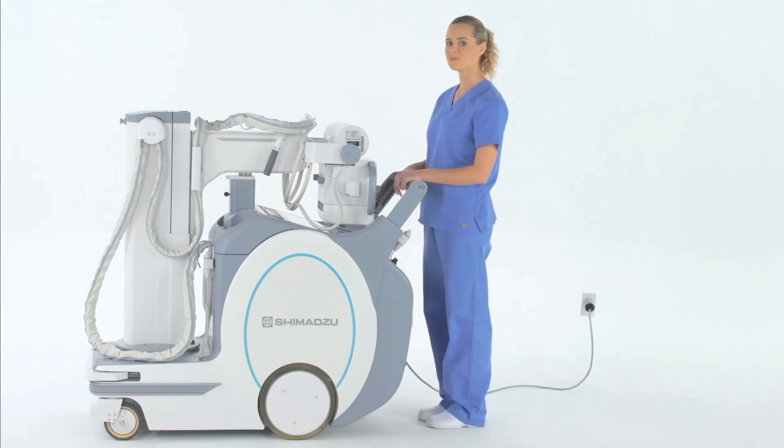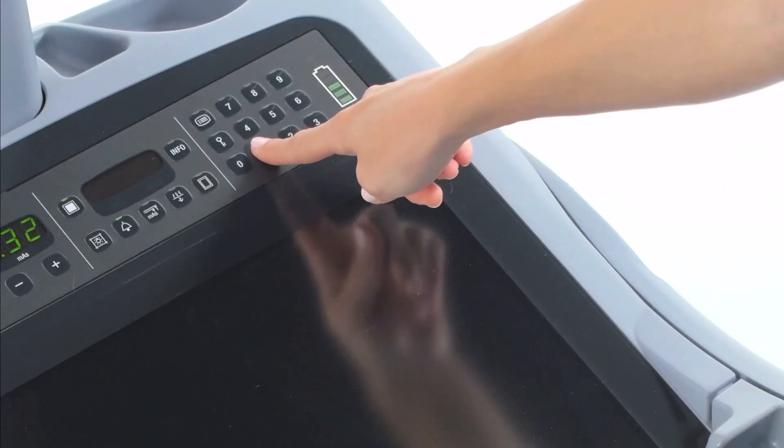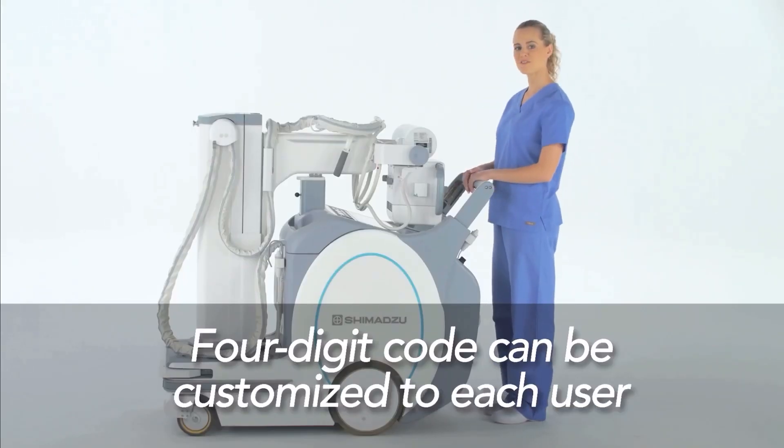To activate the unit, turn on the power switch located to the left of the drive handle, enter your 4-digit code, and press the key button icon. It is now unlocked and ready for use!